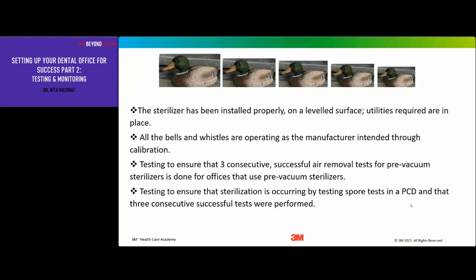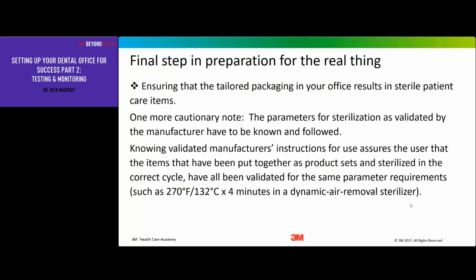PCD, and that 3 consecutive successful tests were performed. So your final step in preparation for the real thing is ensuring that the tailored packaging in your office results in sterile patient care items. Again, I think that we have a tendency to just do our packaging, put it in the sterilizer, let it run.